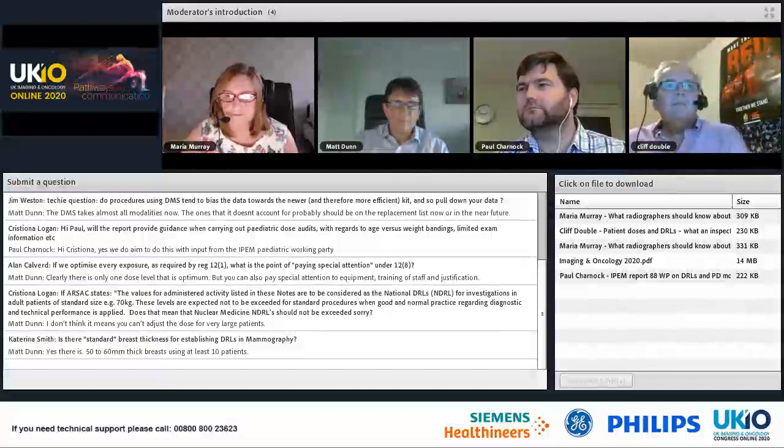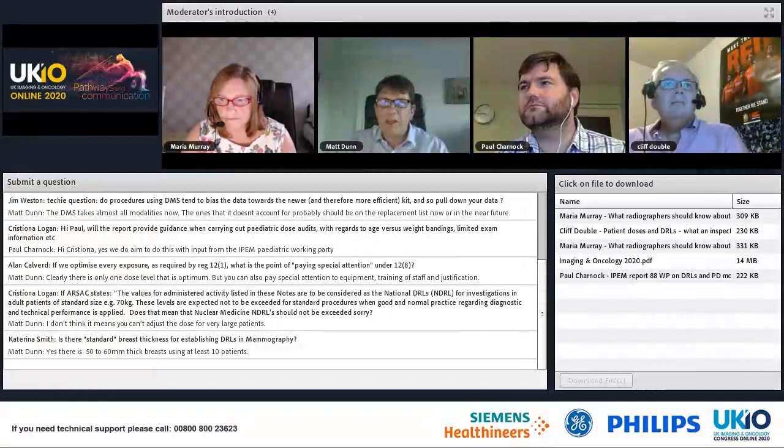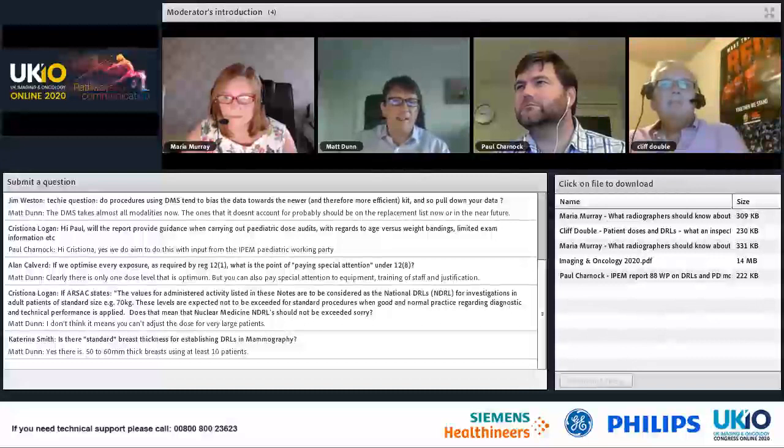Okay, I'm just scrolling down some of the questions now. The progress towards clinical DRLs. I certainly think that quite a number of the national DRLs now are set with a clinical definition to them. So I think we are moving to that more and more. Certainly the last two CT reports have been based on clinical definitions for the national DRLs.